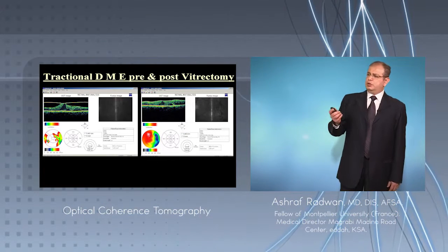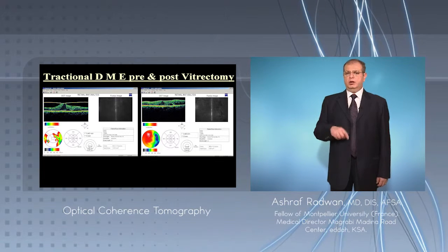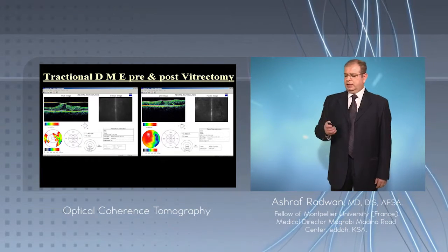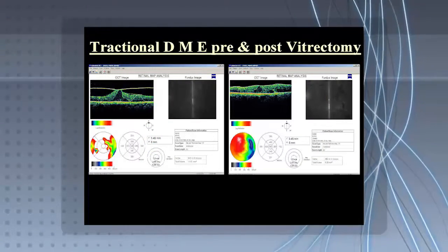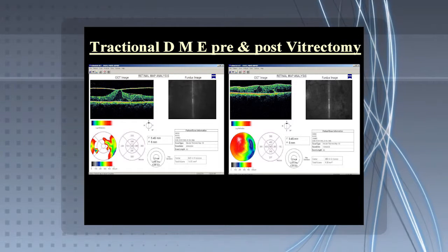As you see, this is an image pre and post. So the OCT helps first to diagnose this case and to evaluate our treatment later on, and to help us take the decision if it needs any intervention for this eye or not.